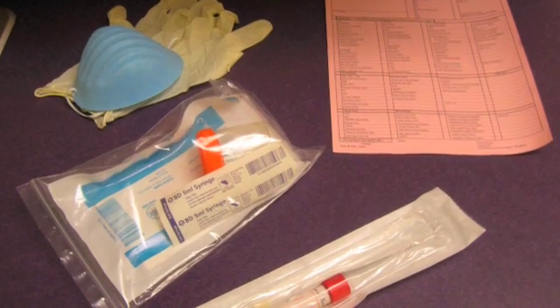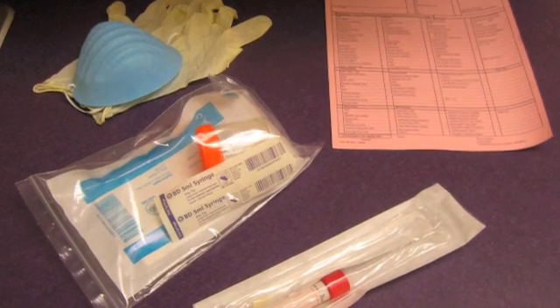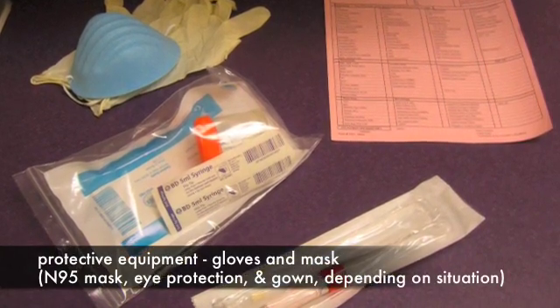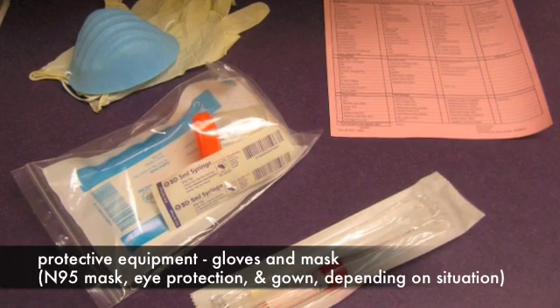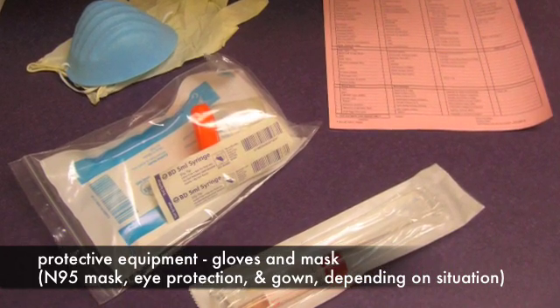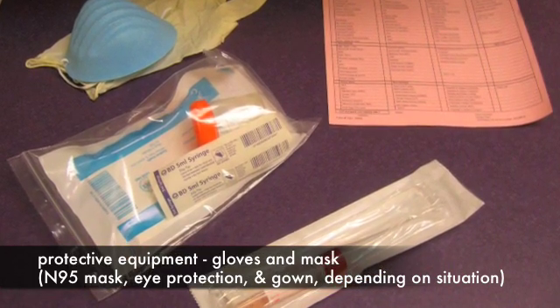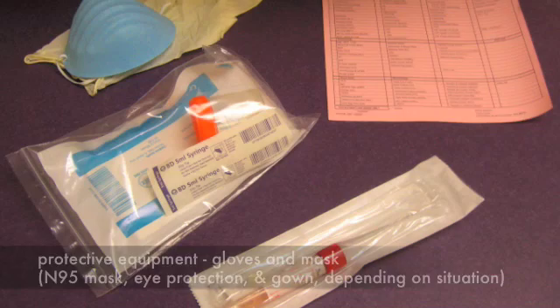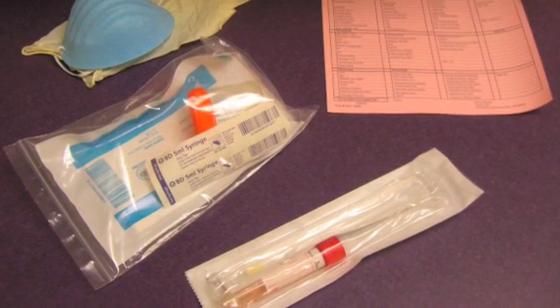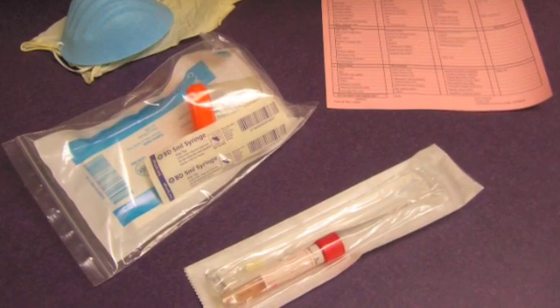To sample the nasopharynx, you will need protective equipment including gloves and a mask. An N95 mask, eye protection, and disposable gown may be required depending on the patient sampled and local infection guidelines.